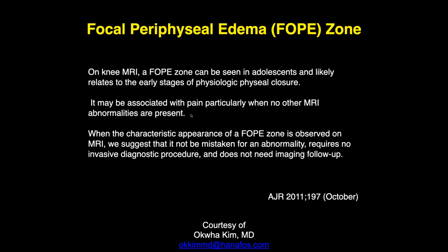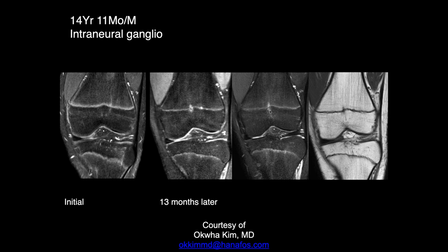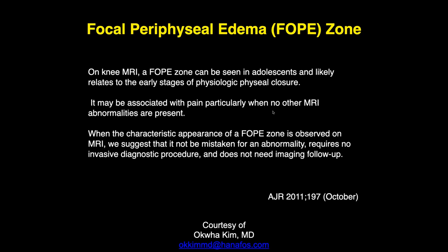That's the tubercle area, isn't it? We're kind of in the middle of the joint, a little anterior to the middle part of the joint here. And that's in the femur. So anyway, these have been described in reports in the literature. These are just normal physiology for these kids.